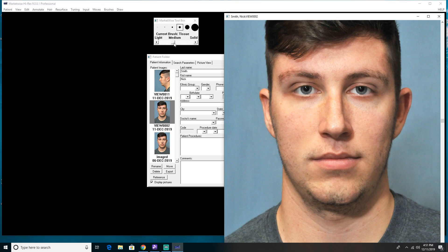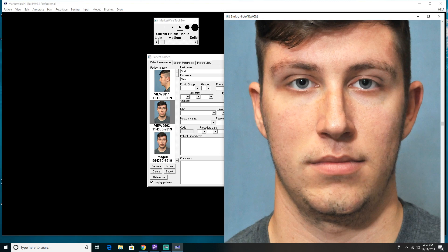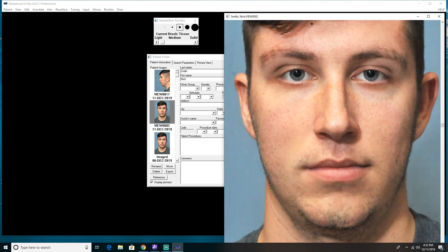This generally defaults to the slider in the middle under medium, but I almost always use the tissue brush very lightly, so I push it down to under the T of light. Now let's go over to our picture. I'm going to click on the picture and zoom in with the End key — Home key zooms out, End key zooms in. It's much easier to work in a large area, so I like to zoom in when I'm working on a smaller area.